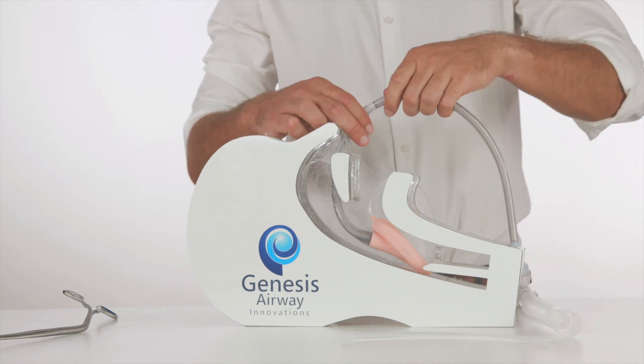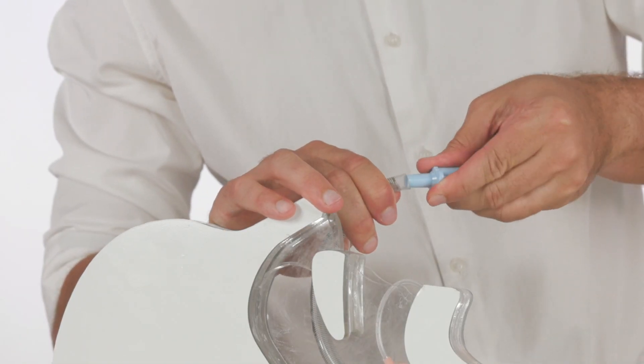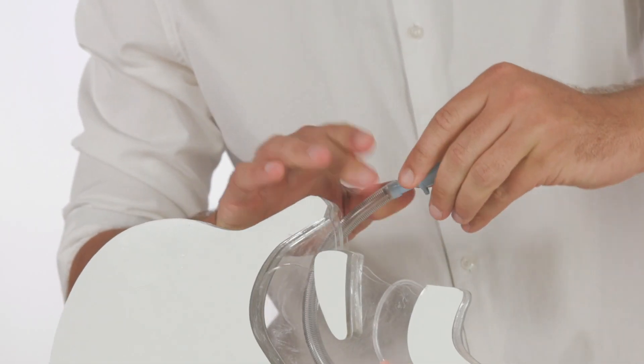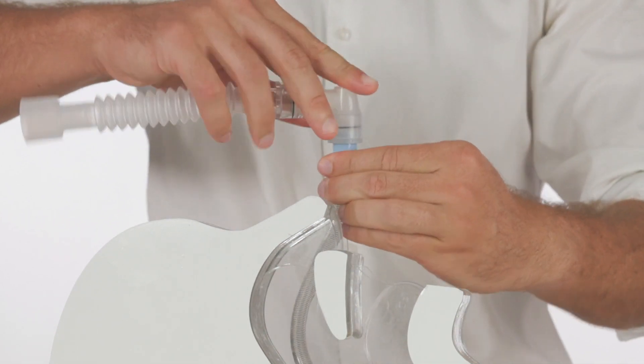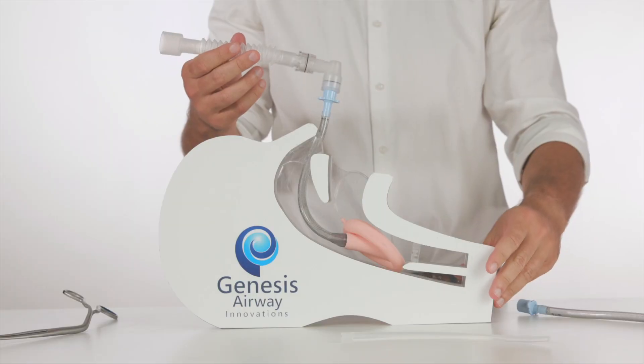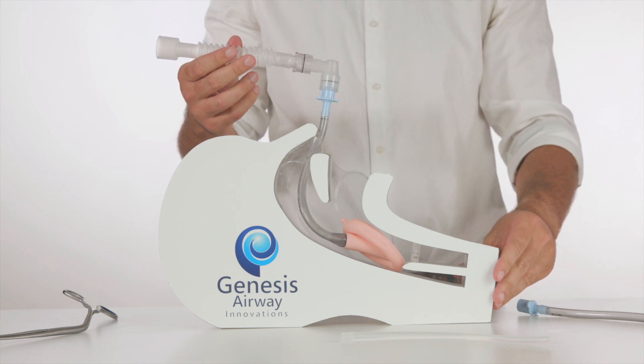The tubing is disconnected and the 15mm connector from the LMA is replaced onto what is now the nasal laryngeal mask airway. The patient can once again be ventilated. There we have the modified retrograde nasal laryngeal mask airway intubation technique with minimal interruption to ventilation.